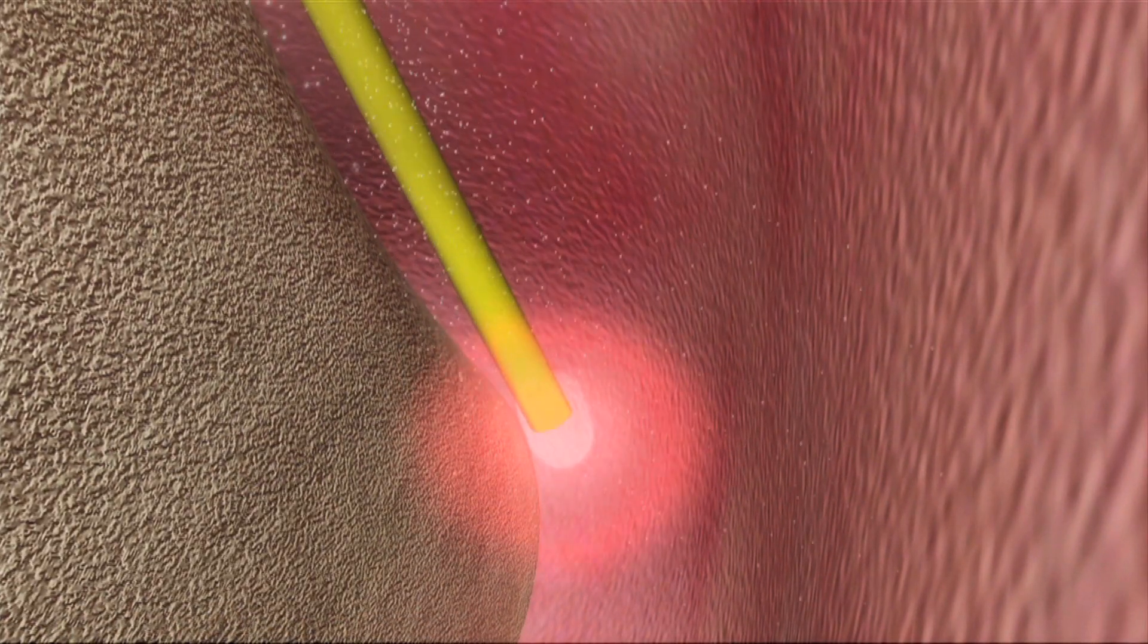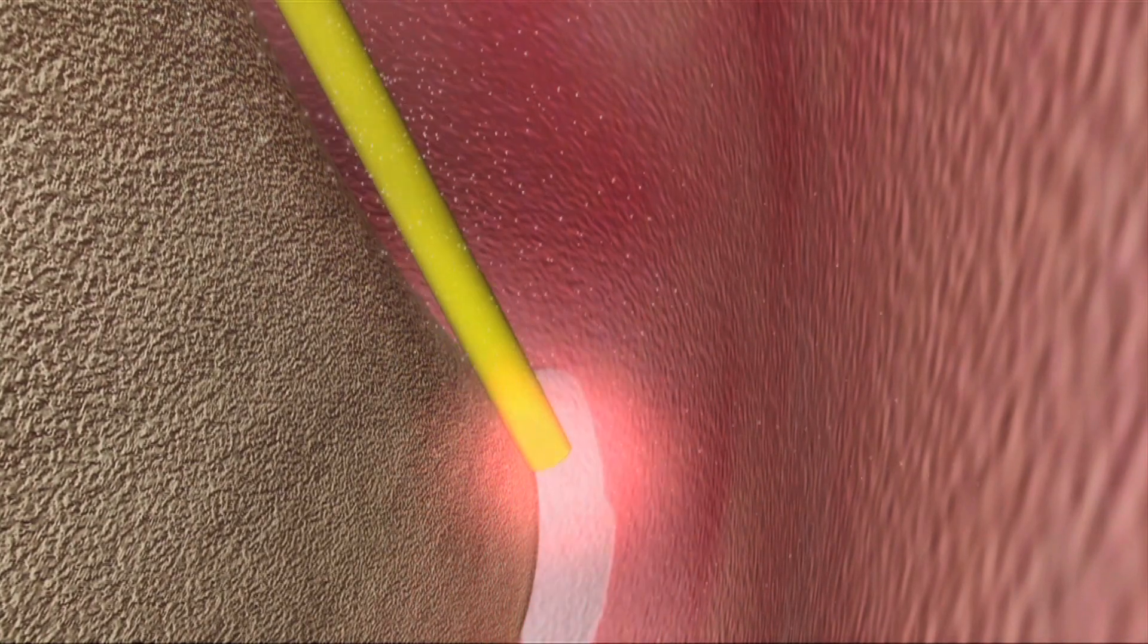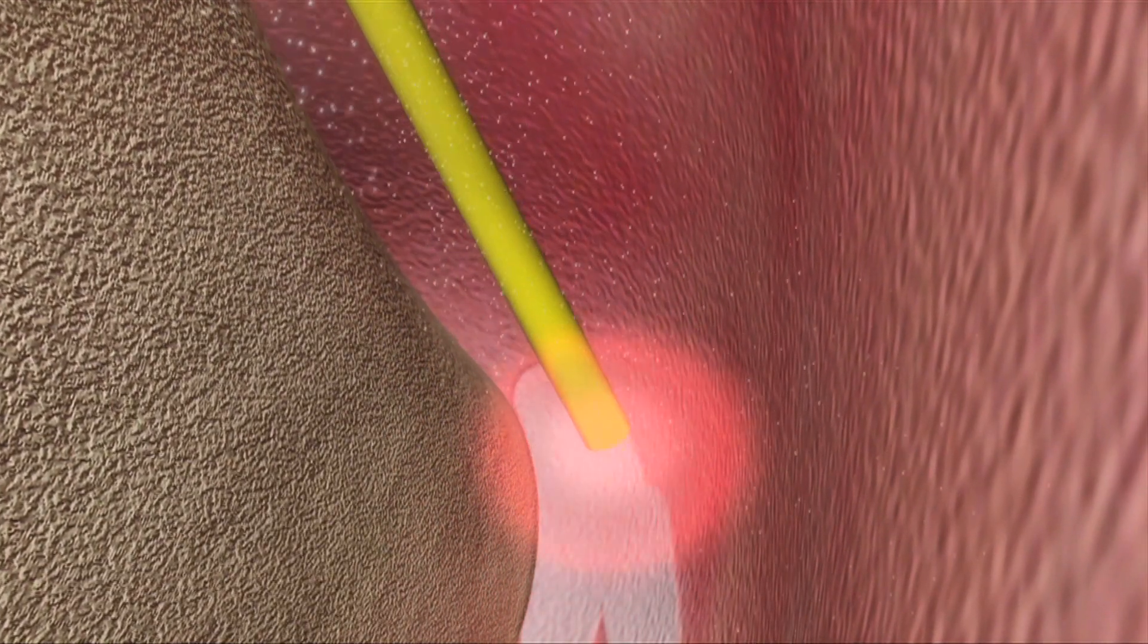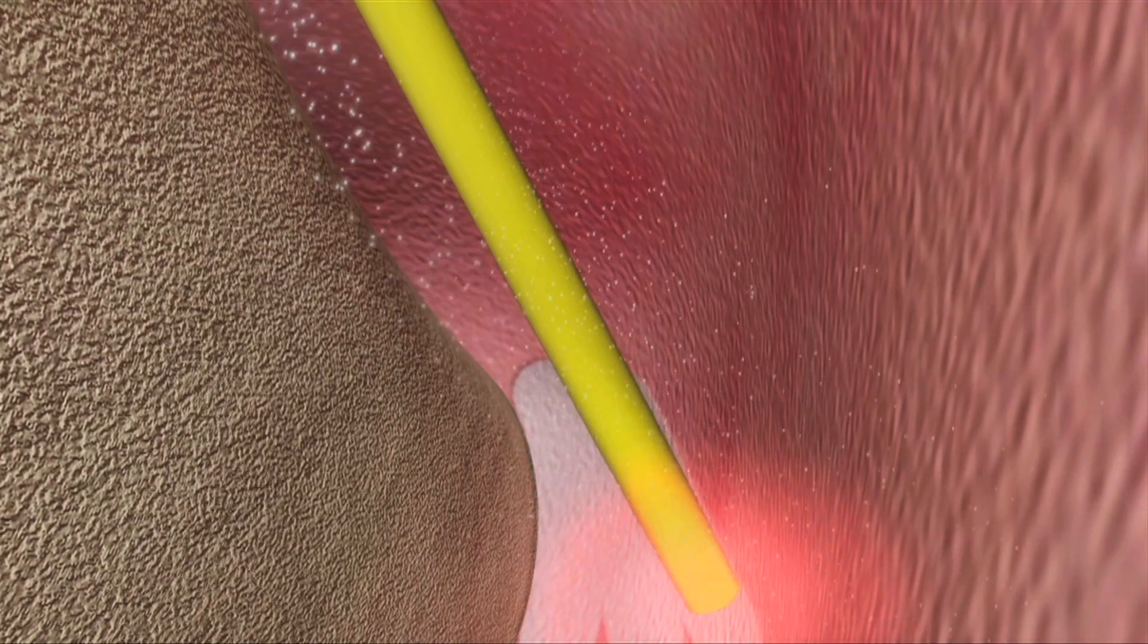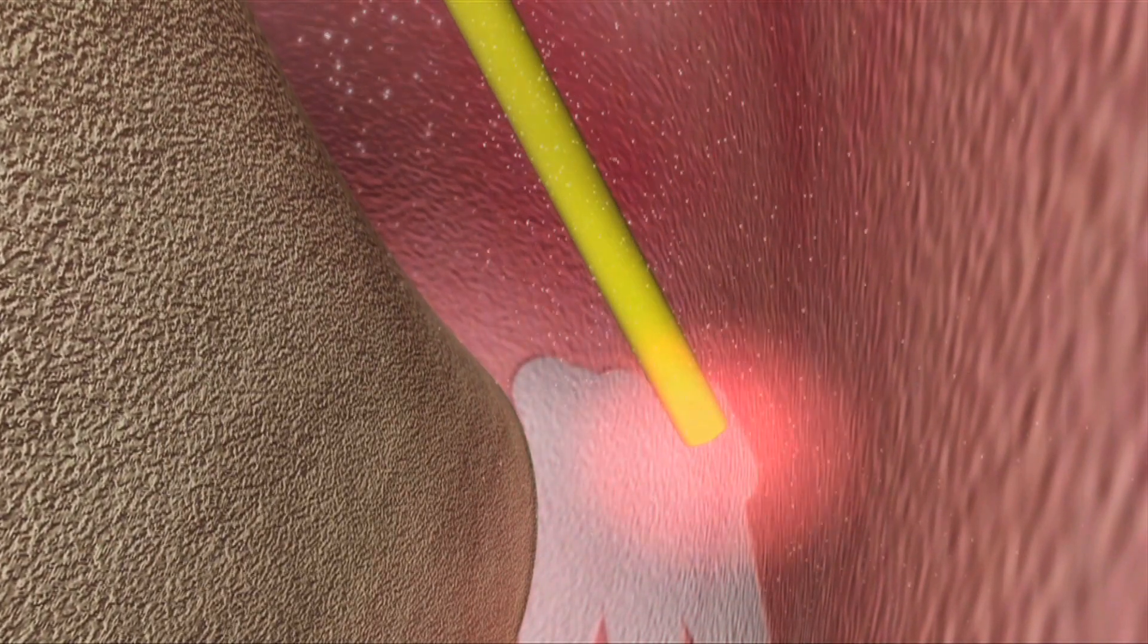The Erbium YAG laser is then used to dissect the periodontal attachment from the bottom of the pocket to the bone. This is necessary to stimulate the regenerative factors from the bone that will help with healing in the periodontal defect.